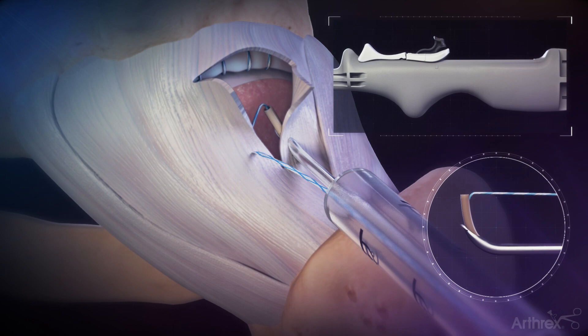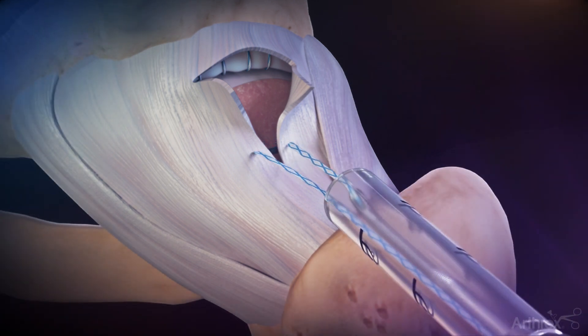Push down and pull the white sliding actuator to its original position. Keep pressure on the white sliding actuator as the device is withdrawn from the cannula to ensure the suture holds well.